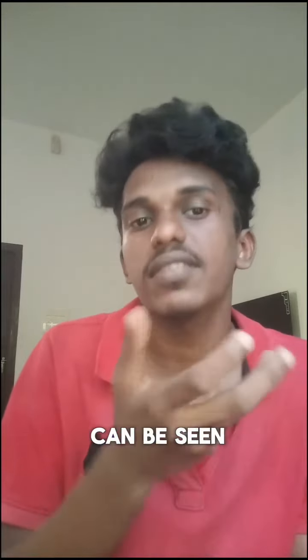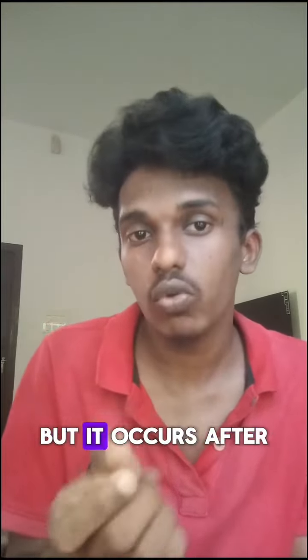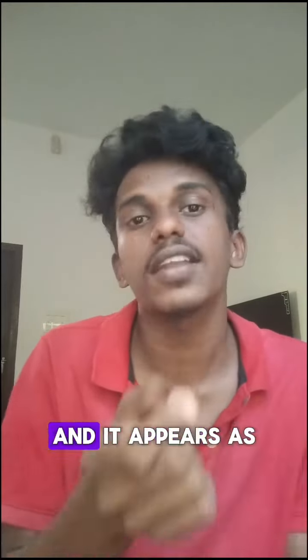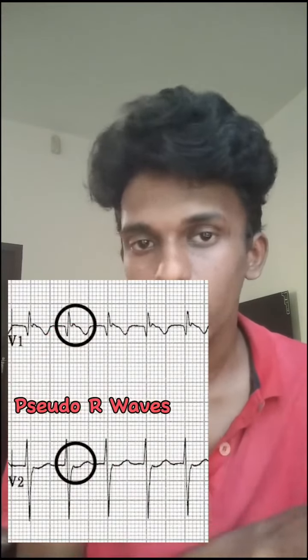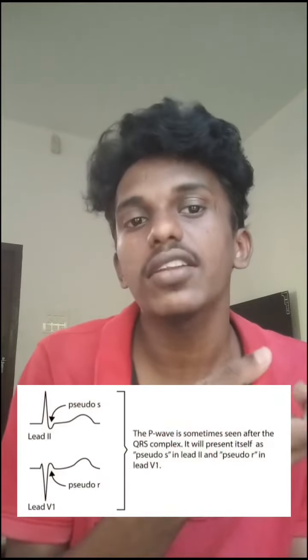Sometimes the P waves can be seen, but they occur after the QRS complex and appear as a pseudo R wave or a pseudo S wave. The pseudo R wave can be seen in V1 and V2. The pseudo S wave can be seen in lead 2, lead 3 and aVF.